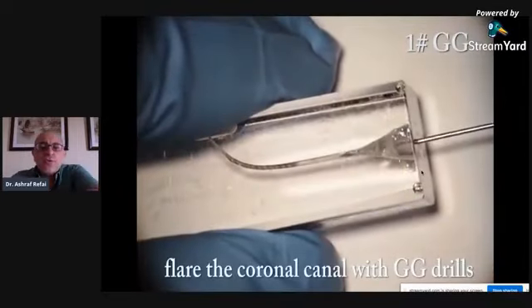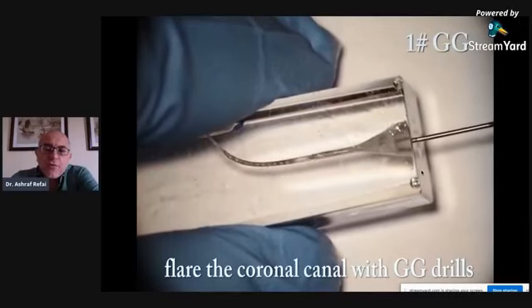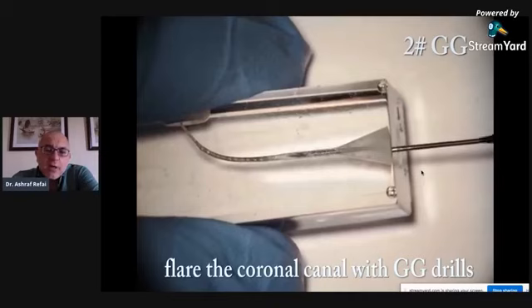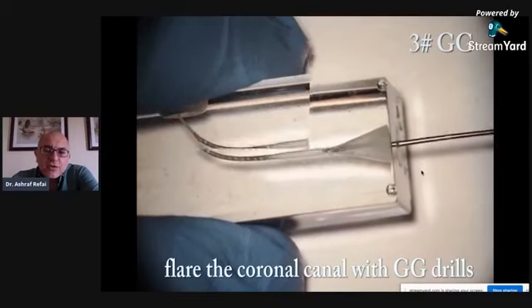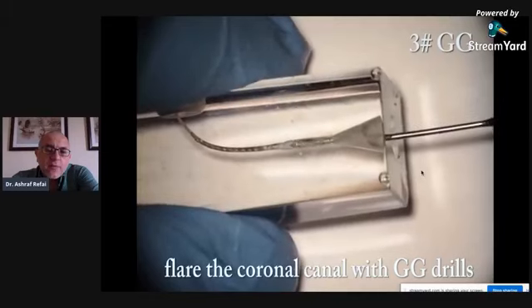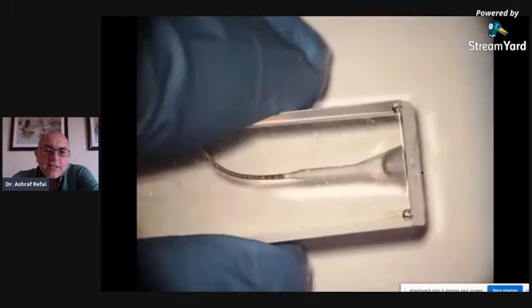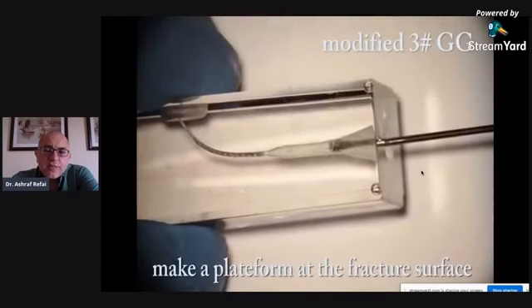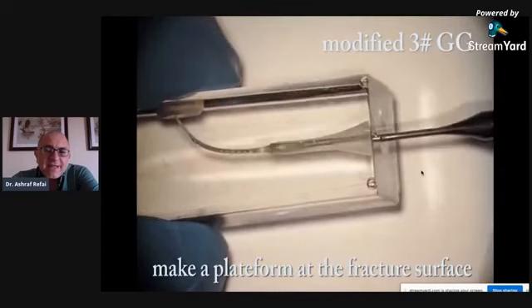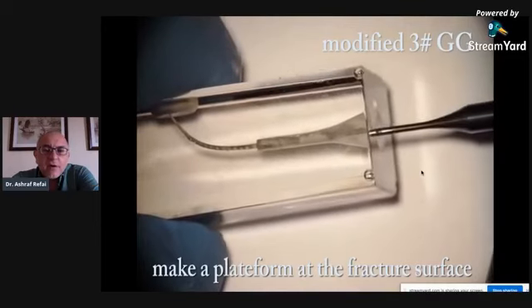Okay, so when we do this instrument removal, we have to create a platform. That means we need to intentionally enlarge the canal above the level of the fracture. And usually we do this using either rotary nickel-titanium instruments, or I prefer Gates. And these Gates are modified so that the tip is flat, and you actually intentionally create a ledge above the instrument fracture.